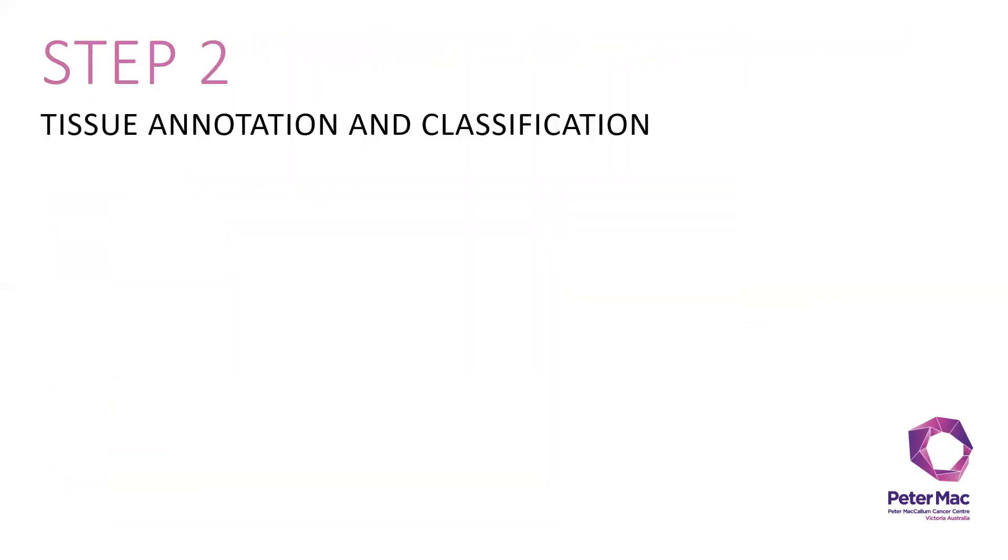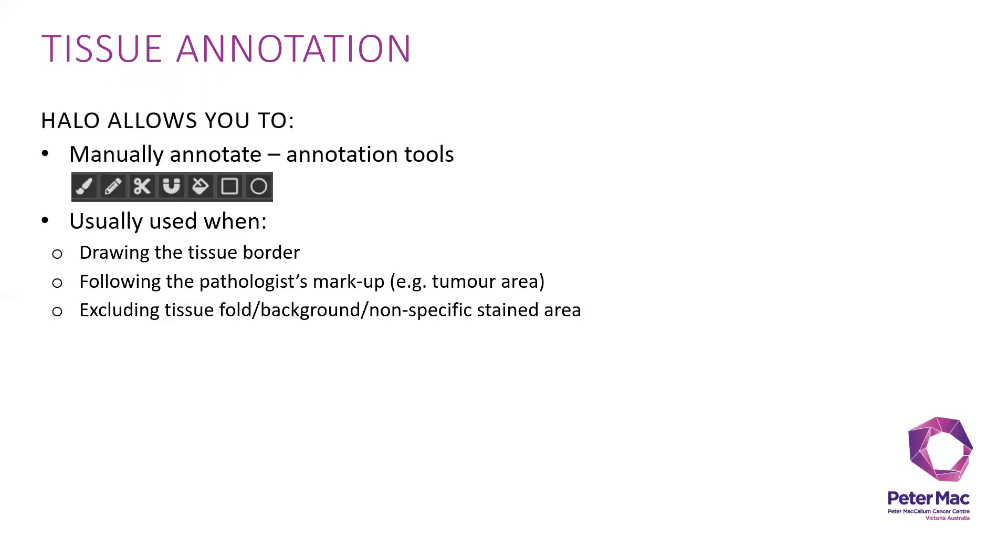After fusing, you move on to annotate the tissue and classify certain classes of your tissue. For tissue annotation, HALO allows you to do manual annotation using the annotation tools. It's usually used when you have to draw the tissue border to limit the space that you would like to analyze, to follow the pathologist markup, for example tumor area markup, to exclude tissue fold background or non-specific stain area.